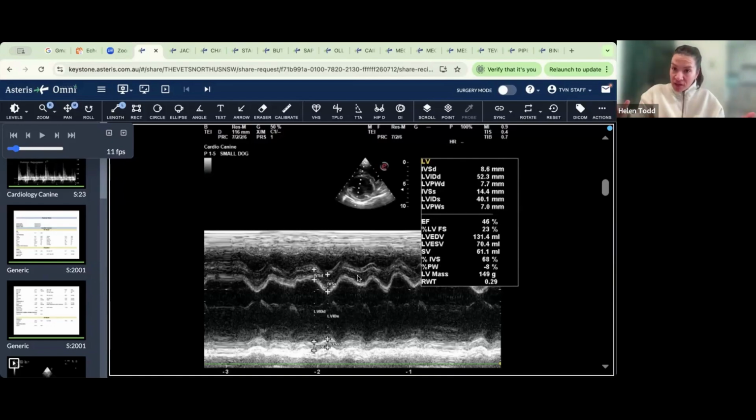And when they're actively in congestive heart failure and they're really volume overloaded, that measurement gets massive. So we put our M mode through. So the bit that we're looking at is this internal diameter. So this black from here, from my mouse to here at the end of diastole. Does that make sense as a concept? Yeah, brilliant.